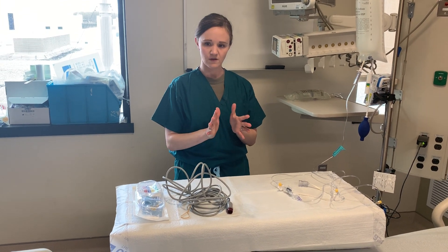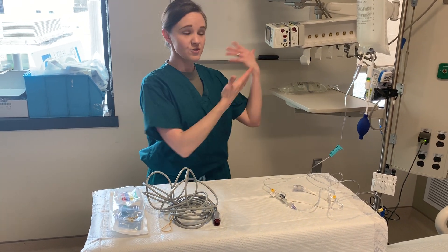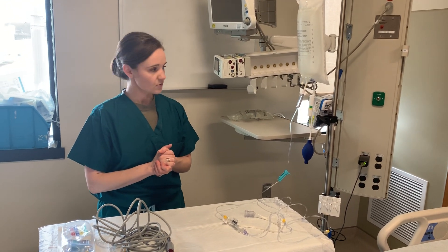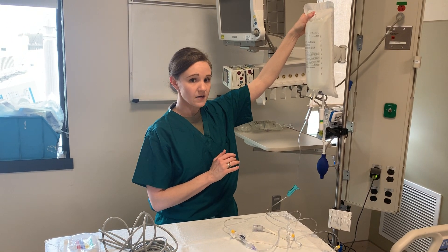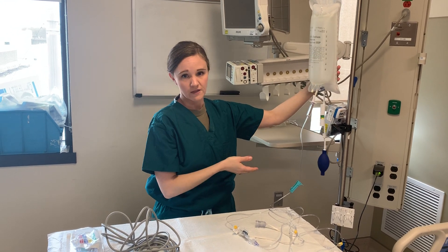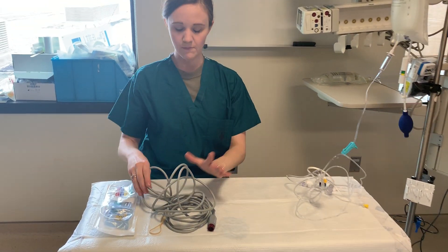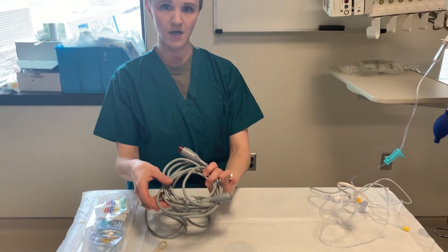To start with I'm just going to explain a few of the items required. I do have this already set up here to show you, but I will explain how to get it all ready. What's required is your pressure bag, a liter of normal saline unless otherwise specified by the provider, your pressure tubing or transducer tubing, and the cable which will connect from the transducer to your monitor.